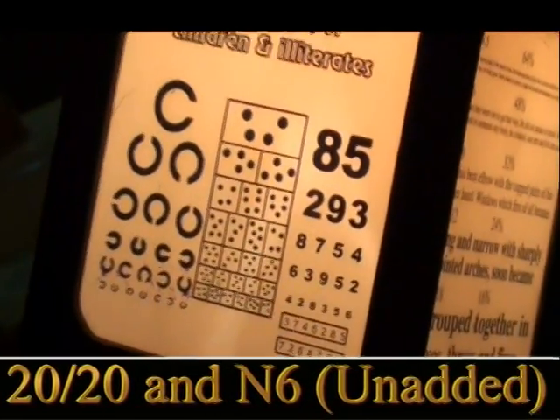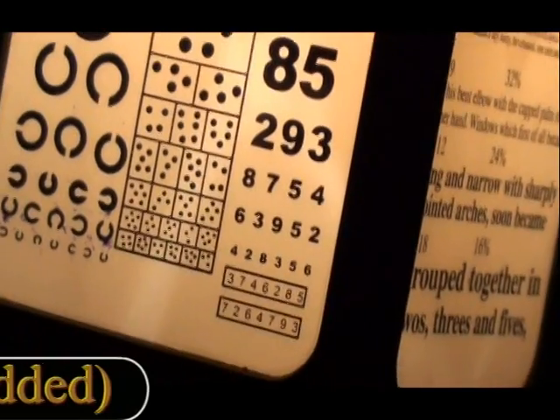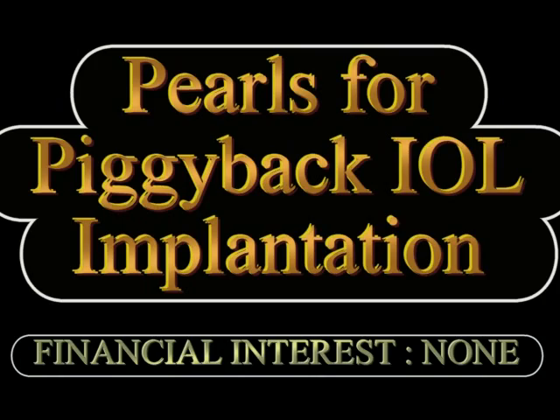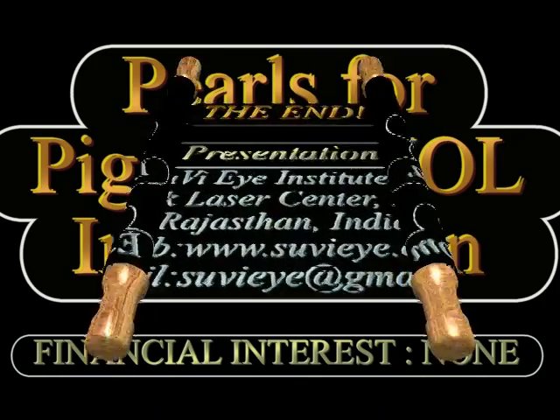The child achieved very good distance and near vision unaided at the end of surgery. To summarize, piggyback IOL implantation, first popularized by Dr. Gayton in 1993, has become a very useful technique for managing both refractive surprises after cataract surgery and primary piggyback IOL implantation in cases of high hyperopia requiring very high IOL power. Different combinations of monofocal, multifocal, and toric IOLs can now be used to achieve extremely good refractive results in these high hyperopia cases. Thank you.